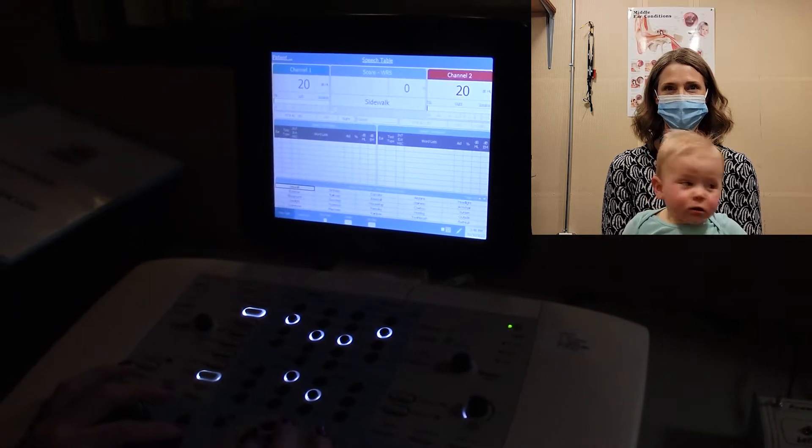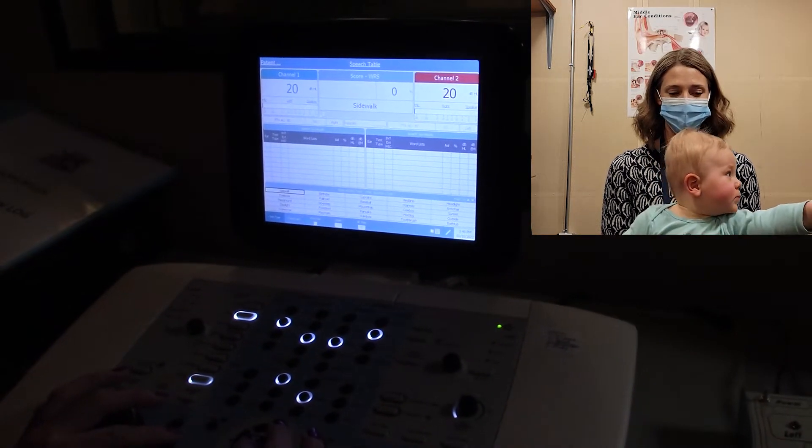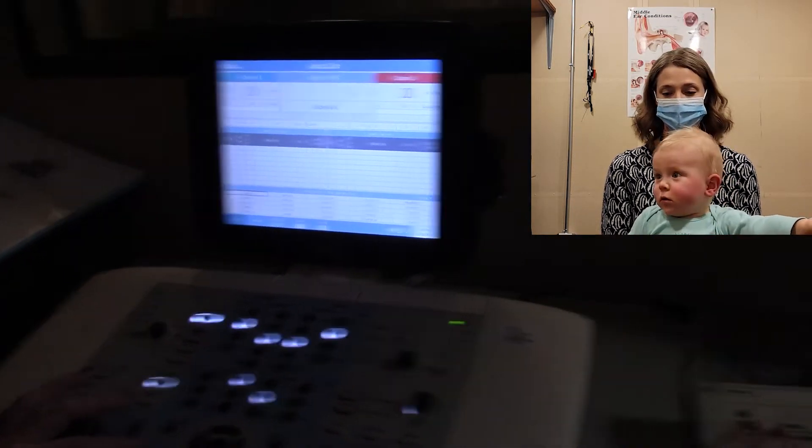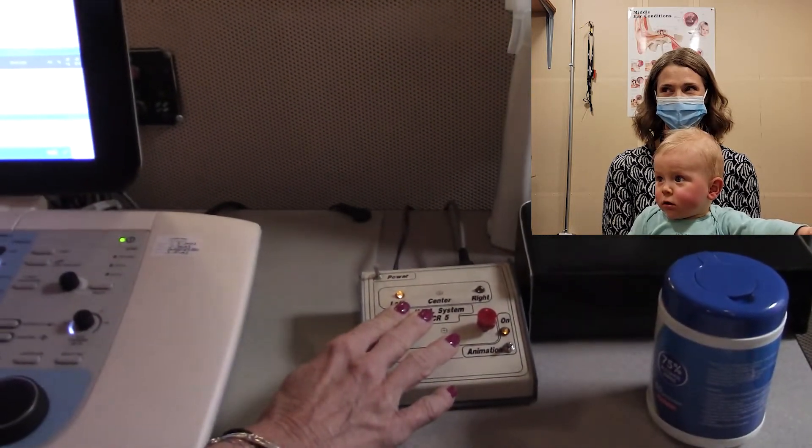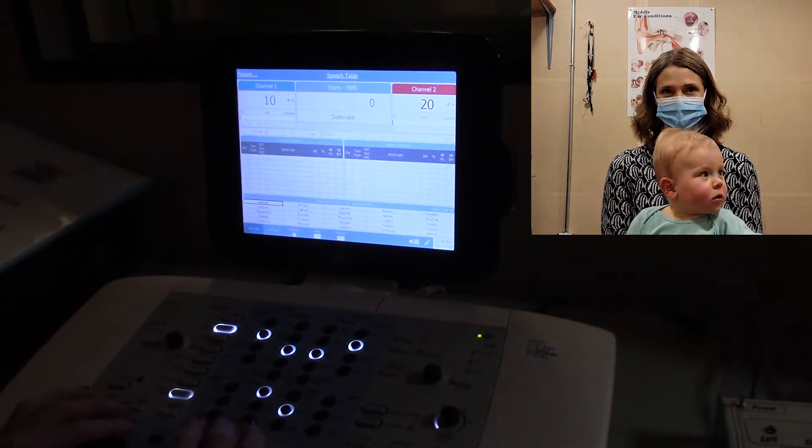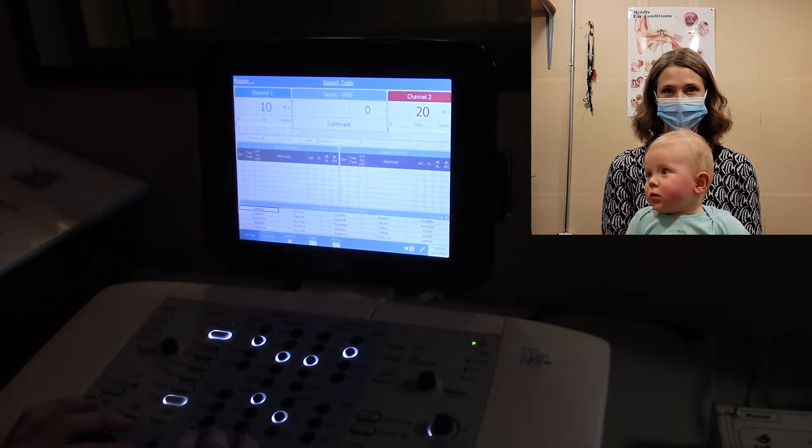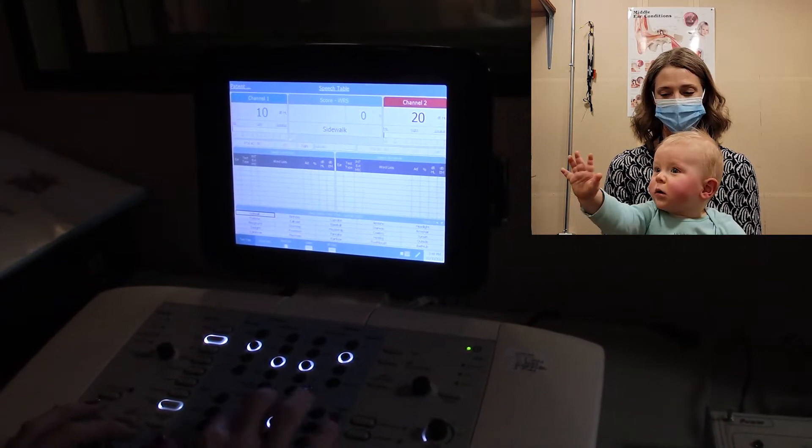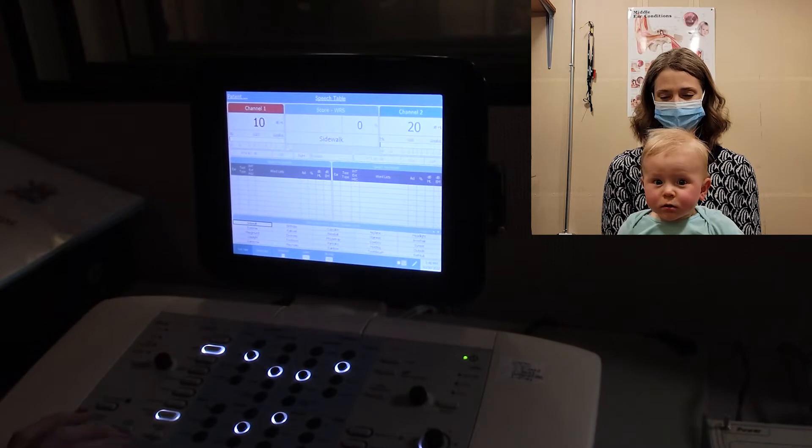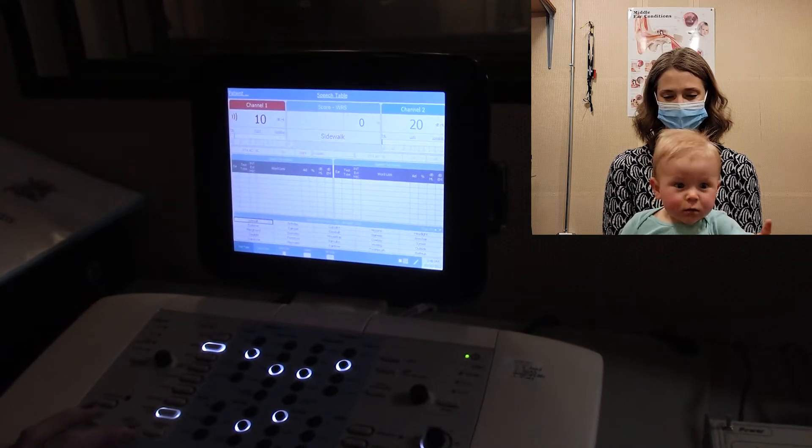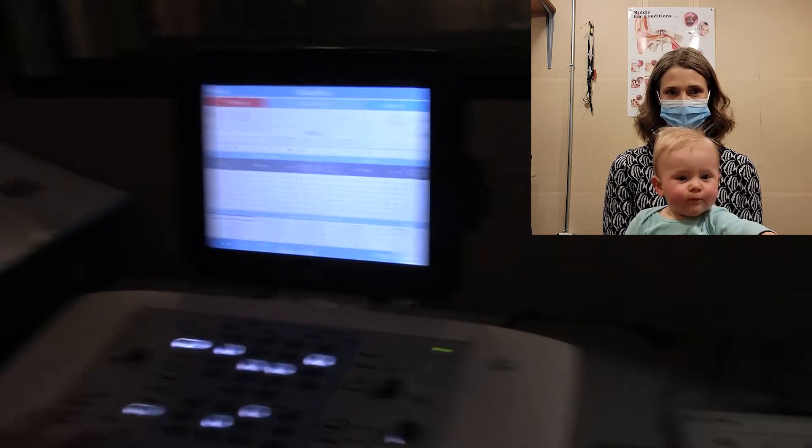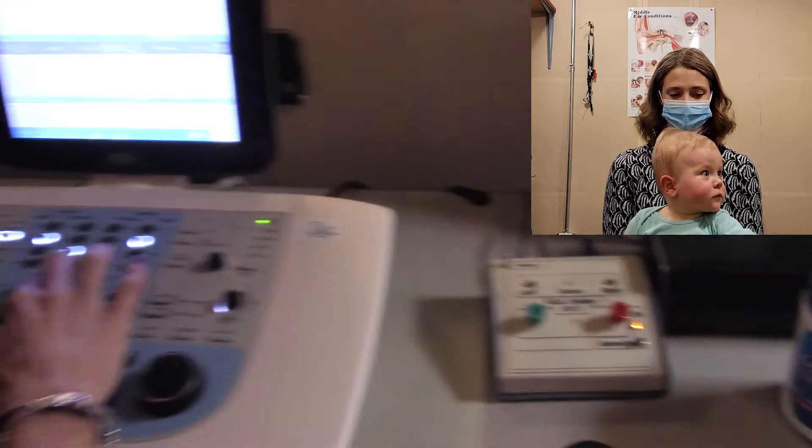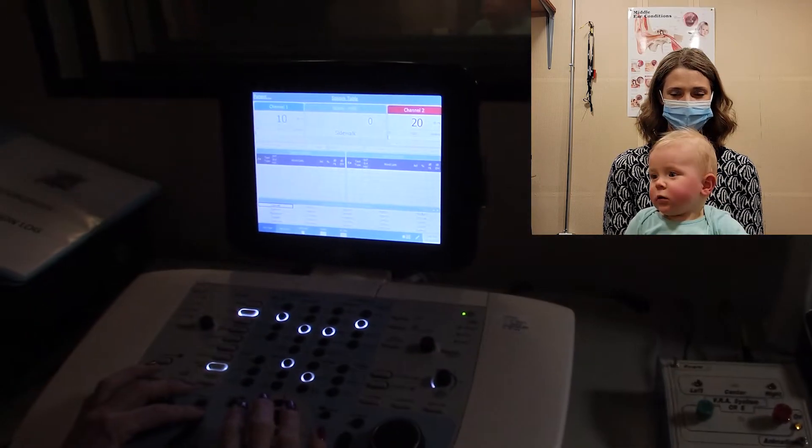I'm going to go to our left. Good job. He's just right on. So we'll go to 10. And we're going to go... He's trying to read my mind. I'm going to go to the right. Not sure about that. He kind of turned right when I presented.